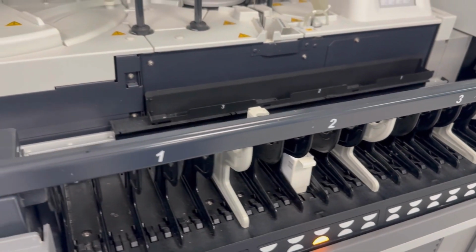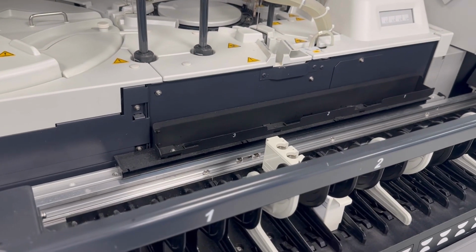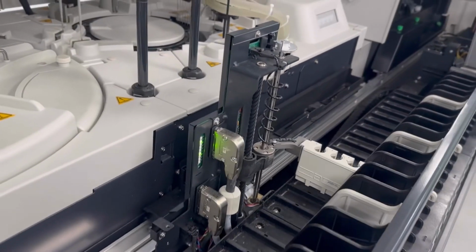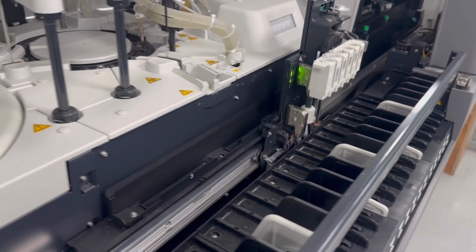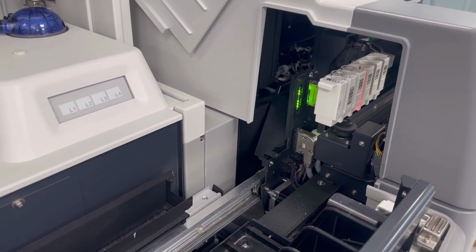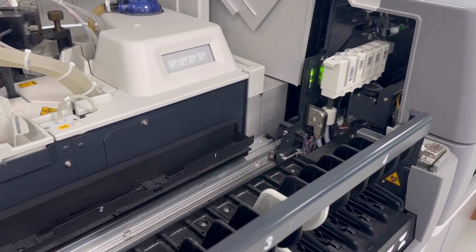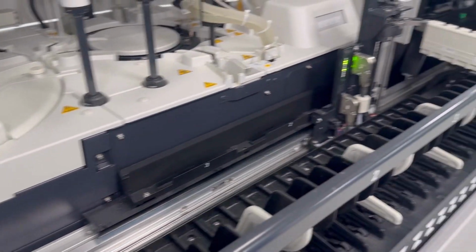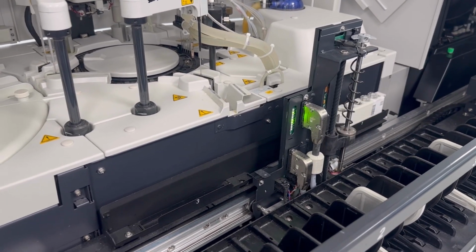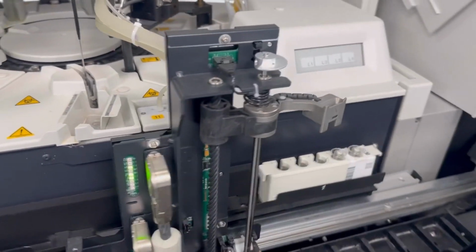process the sample while you are processing the sample in the cup. This is how the sample holder will take it now. It will take it again to the scanner. Here it will scan. Okay, now as this is my biochemistry sample, it will be processed here in the biochemistry section. Now you can see we have three different kinds of probes.